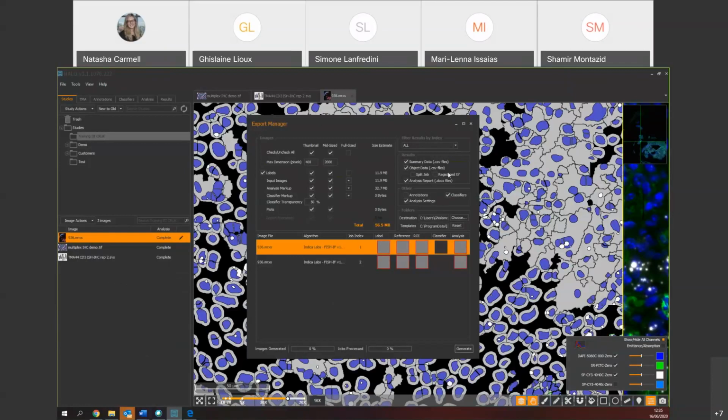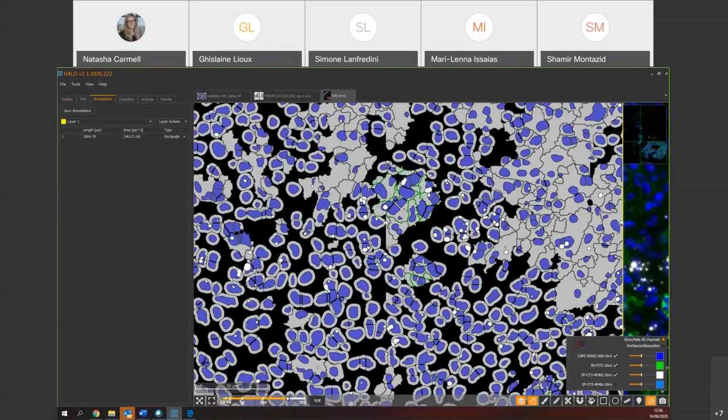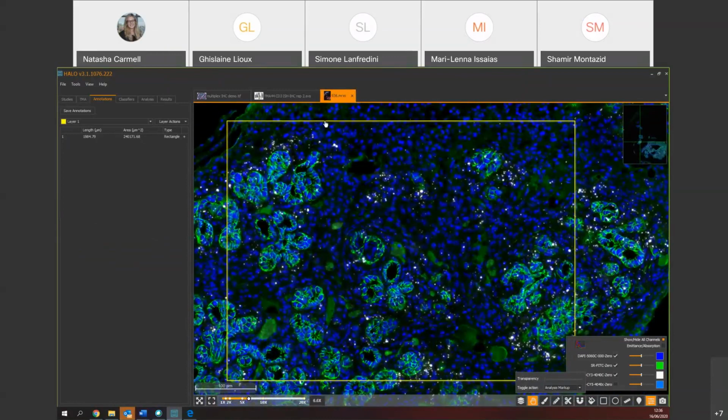Last question, which has probably been shown already: when you did the annotation, is it possible to automatically create random annotations and then analyze them? Yes, you can do it. Let's see. I'll probably just remove this. Let's take this annotation, for example, and click on it.